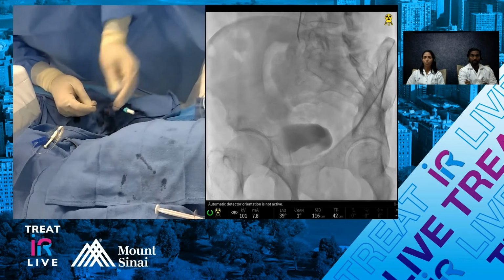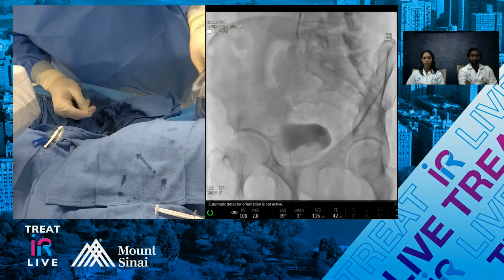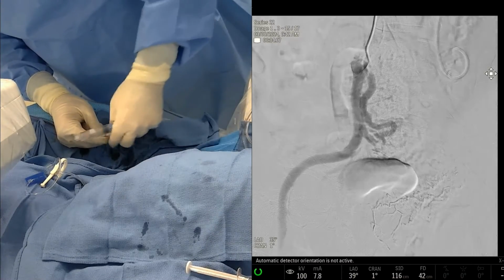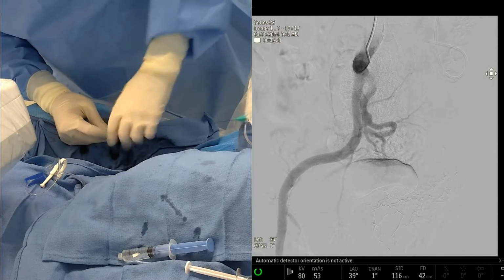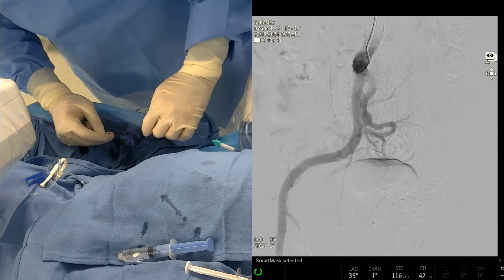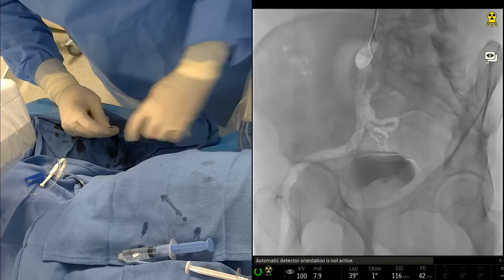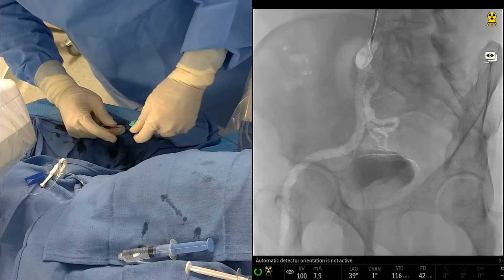Both, Vivian. Honestly, the cases that I've done and I've repeated, and we've all done repeat PAEs, if you see these patients regularly, you realize that years later they start to get recurrent symptoms. They don't always get back to where they were at baseline, but when you bring them back and you do these angios, what's interesting is that sometimes if you just use particles, it looks like nothing was even done.